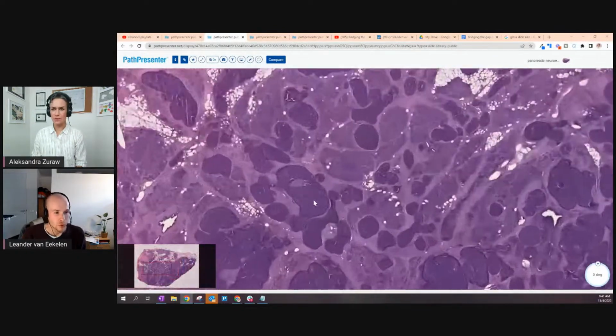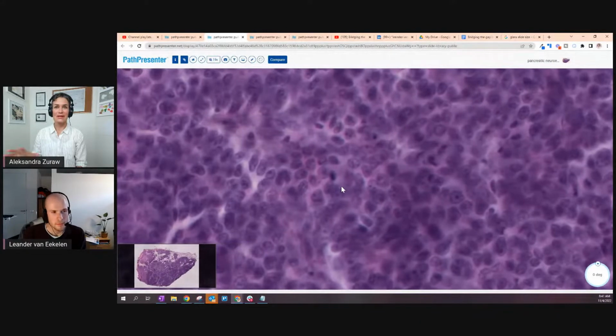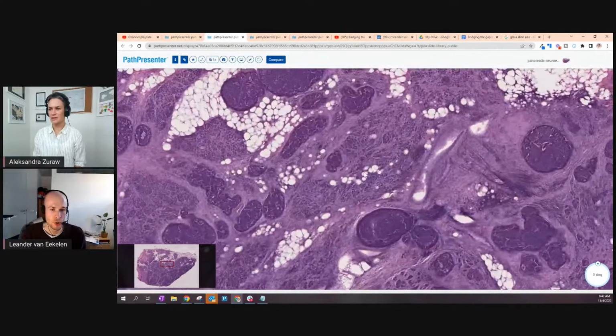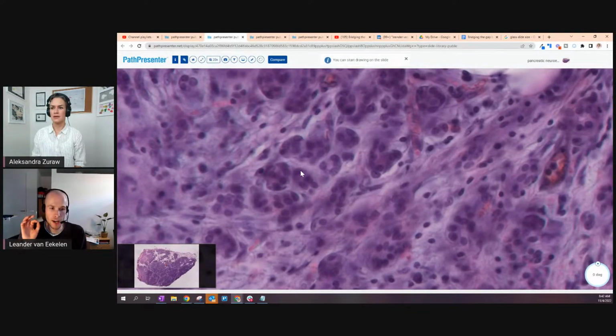surrounds that object. So I can have a visual for us. I need to share my screen. One second. Yeah, so I have this visual, which we have from PathPresenter, and PathPresenter is nice enough and fantastic enough to let us use those images. Those images are there for free, and we can use them. So whenever you need a pathology image for me to pull out, let me know. But basically, are we talking about cells or nuclei? Well, it depends on what kind of object you want to detect, but let's stick to nuclei for right now. So basically, every object here, I need to predict an XY location for where it is, and then have a bounding box surrounding it. That's my version of the bounding box, if somebody was asking.